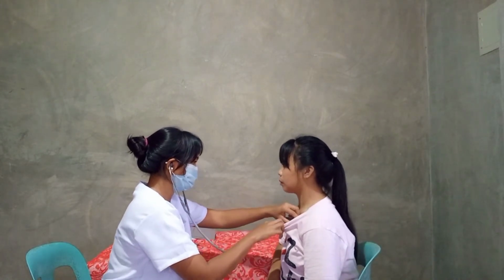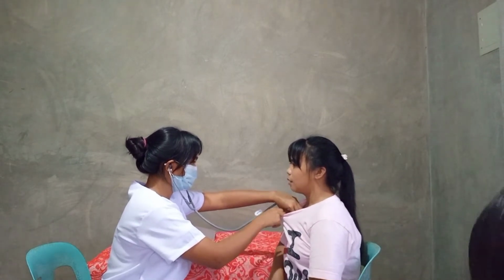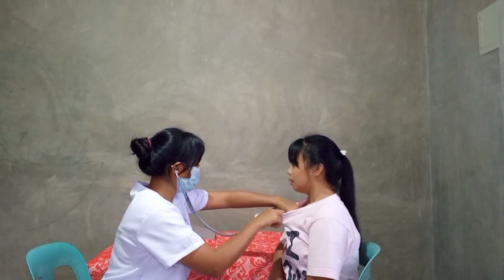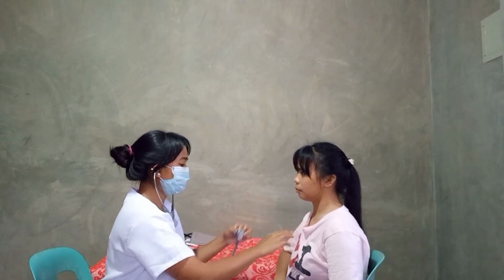We want to hear the heartbeat using the stethoscope. It seems like the heartbeat of the client is normal.